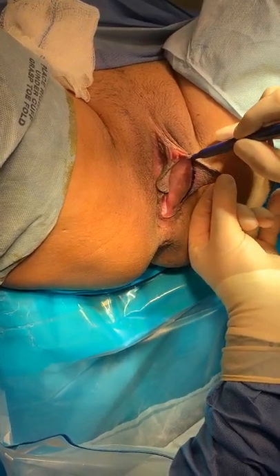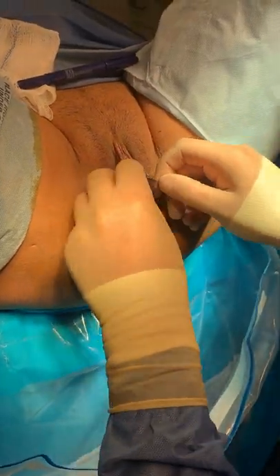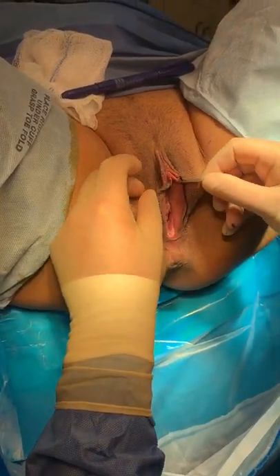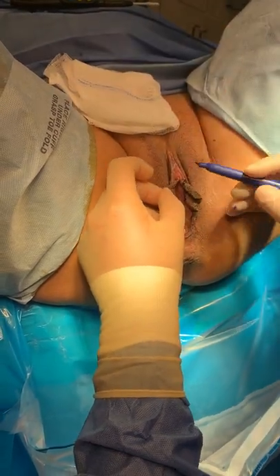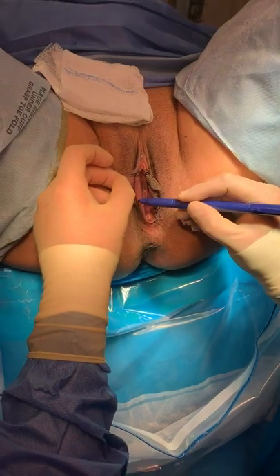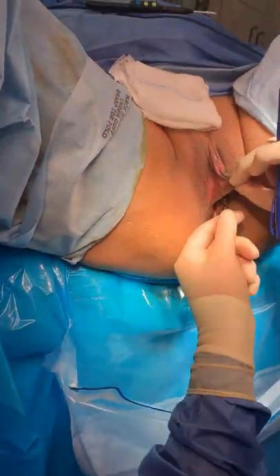This should leave us enough labia that she'll be a lot more comfortable, and then I simply reflect it as if it was a mirror image. I just finished filling in our markings so that there's no confusion, and so now we should be pretty symmetrical.